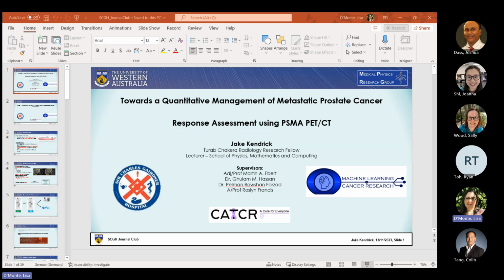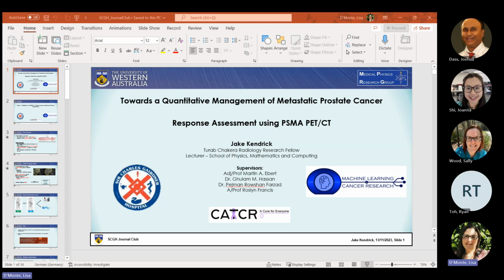Now, one of the key ways that we can analyze medical images is by ascertaining the total tumor burden from those images, right? So understanding what is the patient's tumor burden, and let's say, for example, we have PSMA PET at baseline, PSMA PET at follow-up, approximately 6 months later, say, and we want to assess what the change in the total tumor burden is between those two scans. This is an important way to assess whether a patient is responding to treatment or not, especially in metastatic disease, when disease can be very high volume.